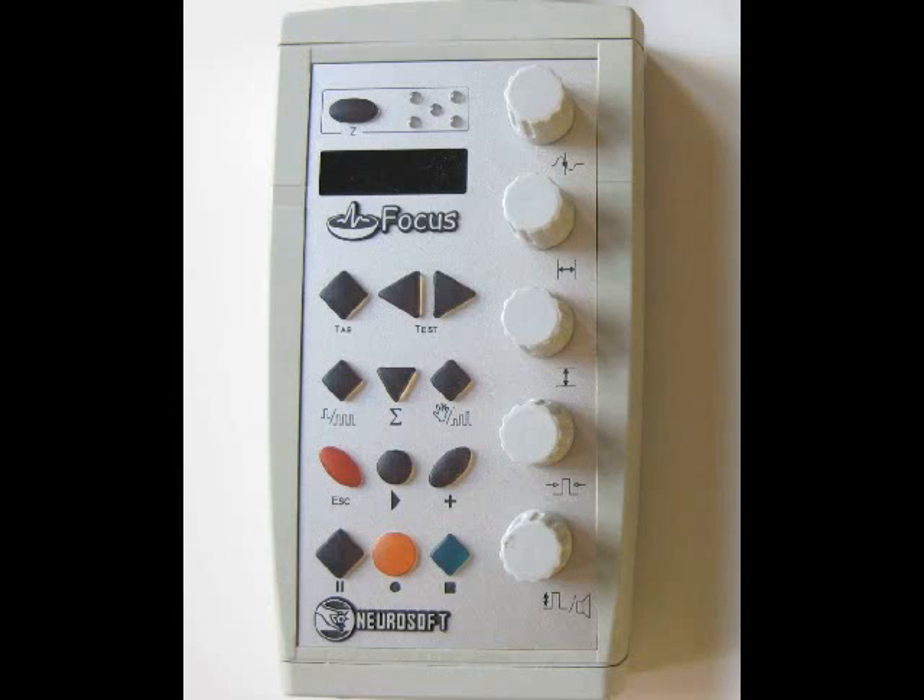Welcome and congratulations on your purchase of the Focus EMG machine. This is a sophisticated two-channel EMG machine that fits in the palm of your hand. One thing it does not have is its own independent power supply, because we wanted you to have the least artifact and interference possible during your study. It draws its power from your laptop via a simple USB cable.